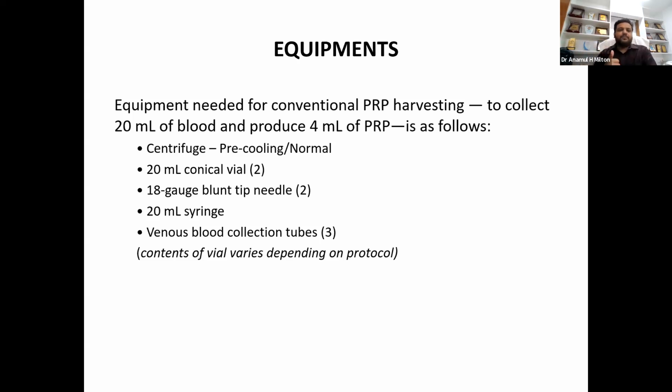Then an 18 gauge needle, because when we take more than 21 gauge, sometimes when it travels through the needle, it breaks.